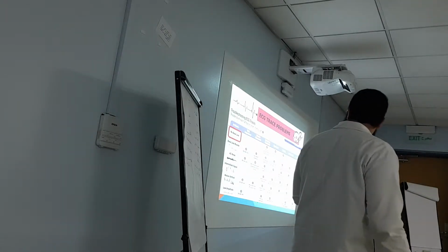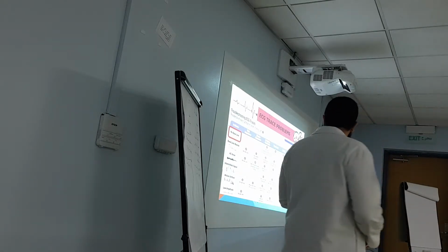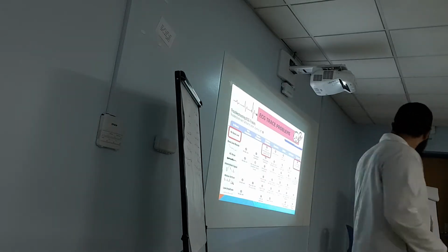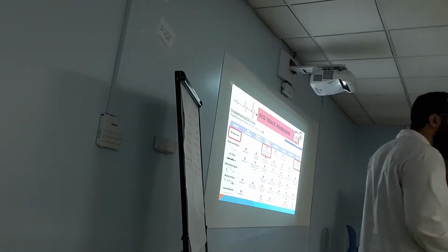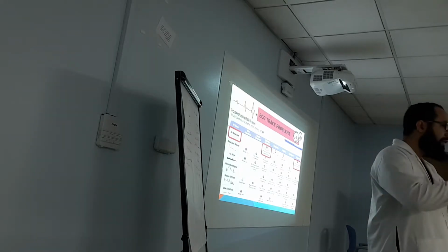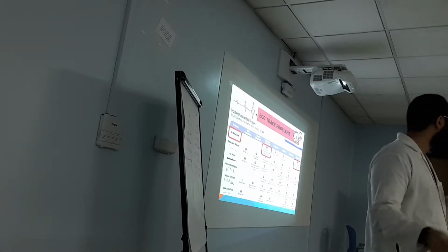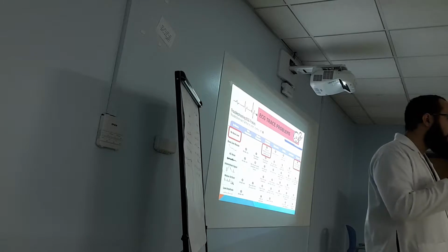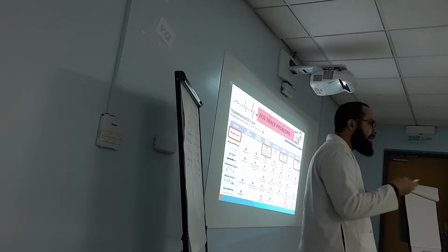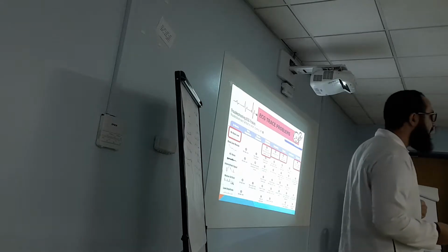So let's say examples. If you have no baseline, means connection problem, probably. So check the leads are connected, make sure the machine is set up, make sure the connections, make a continuity check. So what's the continuity check? You start from the patient until the machine. Everything is okay: from the electrodes, from the leads, from the modules, for the main cable, for the machine plugged in, the cable plugged in the machine. And check for the proper cable. Maybe the cable is not compatible with the machine. Someone fixed the wrong cables. And make sure the skin is dry.